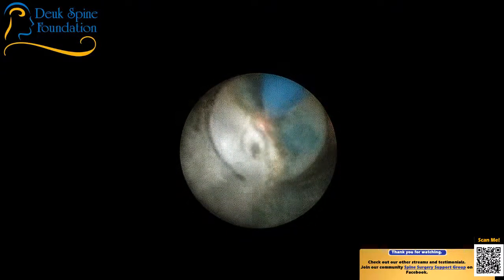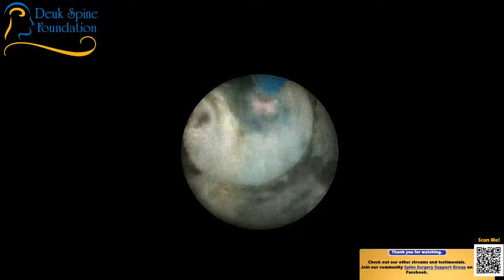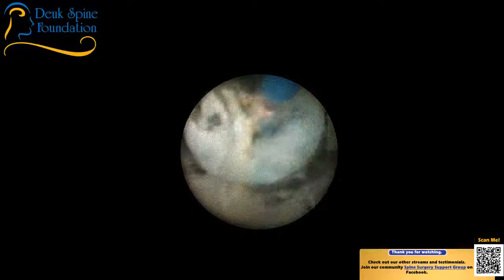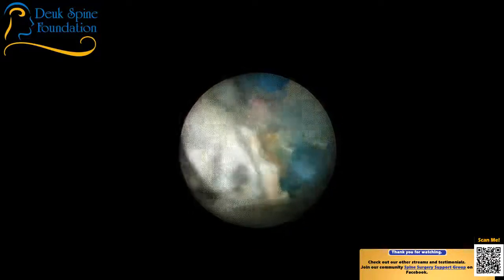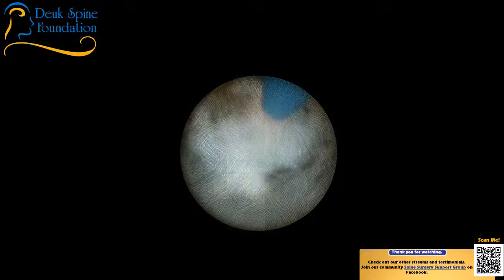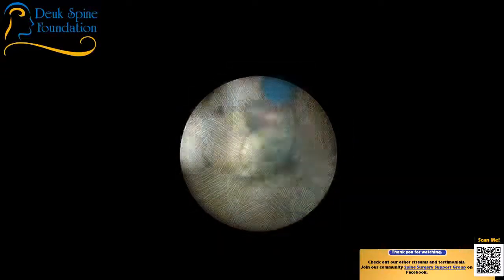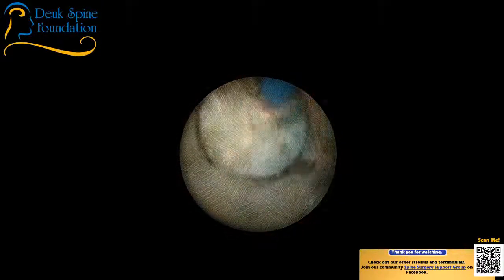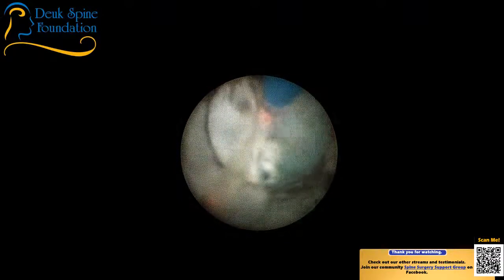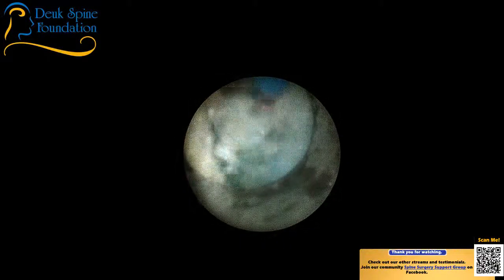That's bone spur right there. The golden color stuff that I'm working on. The blue stuff is herniation. This is out the foramen. This is the left side at 5-6, C5, C6. This is herniation here. Trying to clean it up. Bone spur right here. Got rid of it. You see that right there, the golden stuff? That's all bone spur. Easy to get rid of with a laser. Almost done.